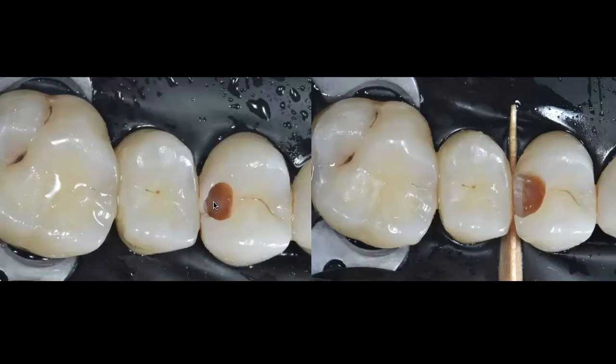If for whatever reason I feel that the affected proximal wall is not just crumbling down easily, it's not going to break down easily, it's just not going to flick off, then I stop using my handpiece, and what I do is what you see on the right hand side. I use a medium to large size wooden wedge, and I want this wedge to create a lot of pressure in between these two teeth. So you're going to select the wedge that you feel is going to be able to go through and through, but that it's also going to create some pressure in the area.